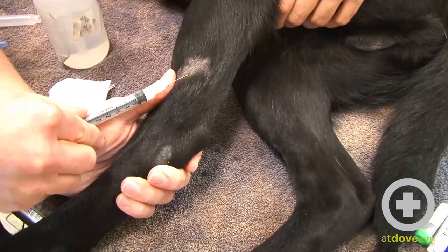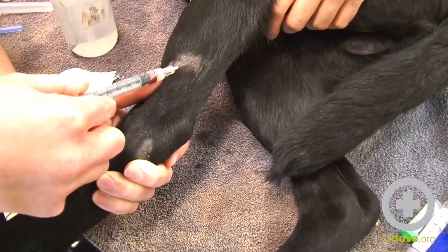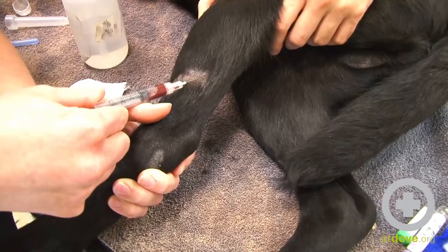I like to kind of stabilize with my thumb. You can see the vein moving a little bit. I'm just going to slide underneath the skin here. It helps to kind of stabilize the syringe with your thumb. Sometimes these can be a little bit positional as well, so just try — and there we go.